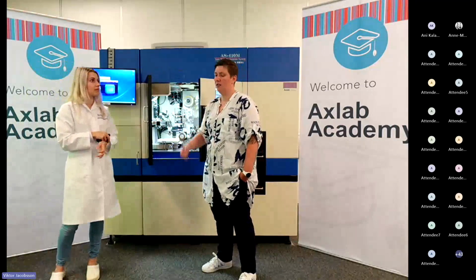How do you select your blocks before they go into the system? How do you review the output quality? That has created a new role within pathology that we might not have seen before. Maybe we saw a little in relation to digital, but now it's clearer that we need these very tuned, focused quality persons.